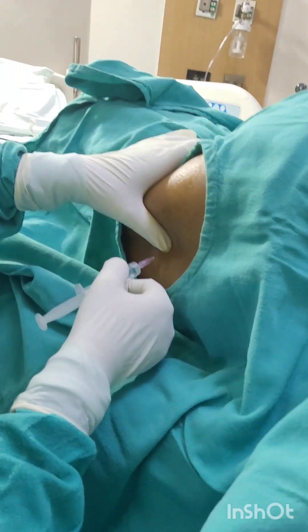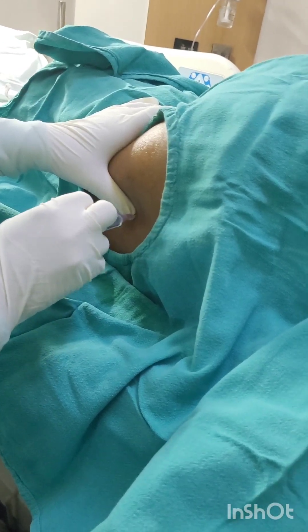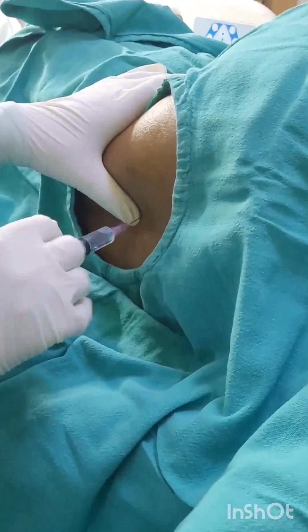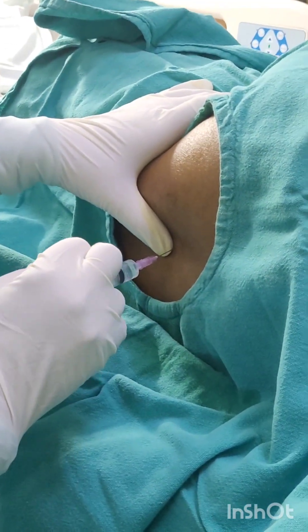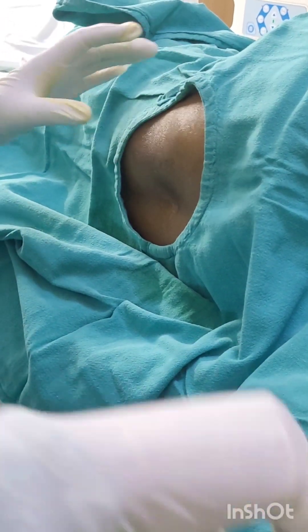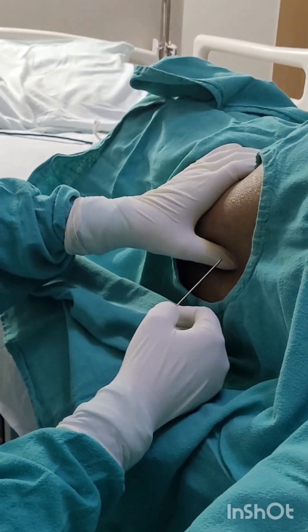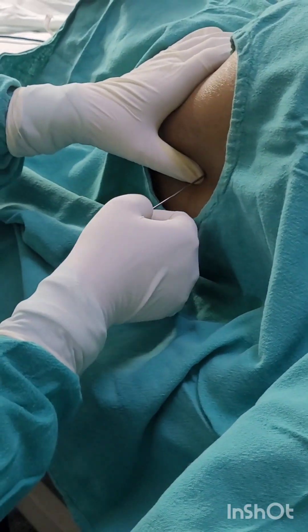Then with the lumbar puncture needle, which contains a stylet, you have to pierce the needle. Right now I am inserting the lumbar puncture needle. What is the contraindication of doing a lumbar puncture? You have to rule out any raised intracranial pressure, otherwise it may cause herniation.